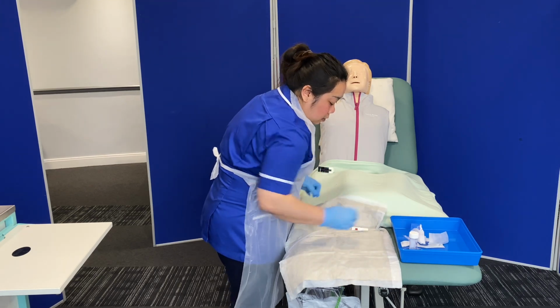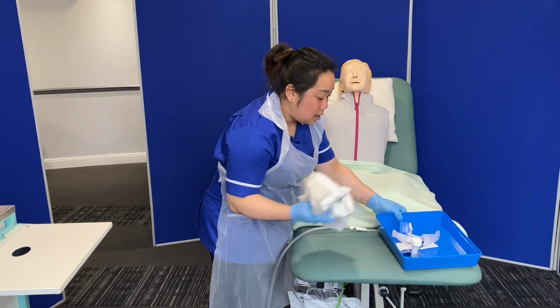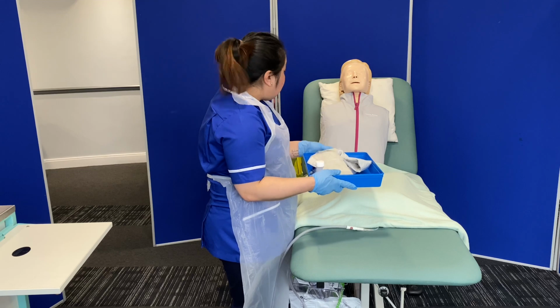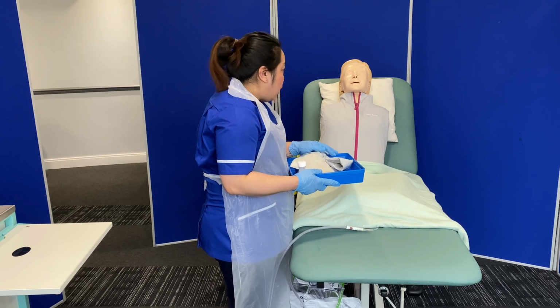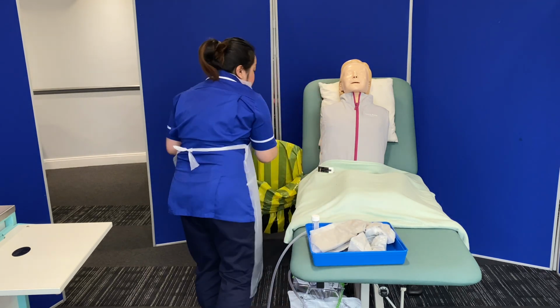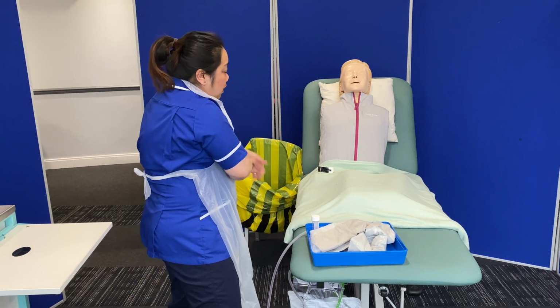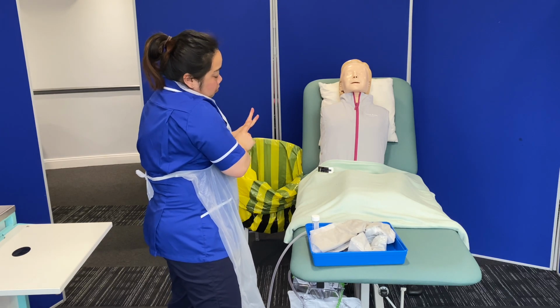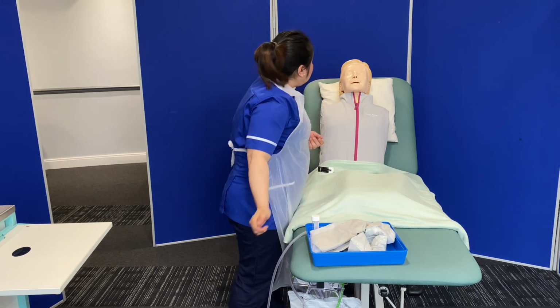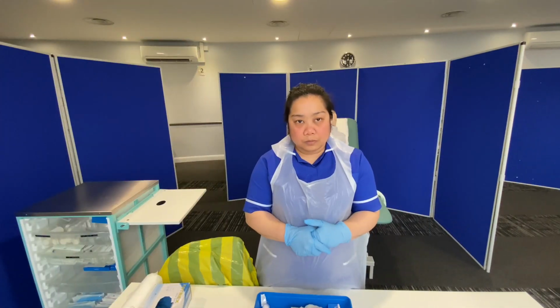Perfect. Right, so I'm going to get this out of the way and dispose of my equipment correctly, as well as send the sample to the laboratory. Do you need anything else, my dear? No, I'm okay. Perfect. So I'm just going to discard my gloves and gel my hands so I can give you your call bell. Here you go. Please don't hesitate to give us a buzz, okay? Okay, thank you. Perfect.